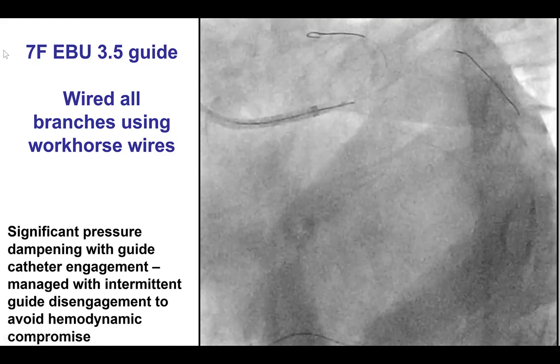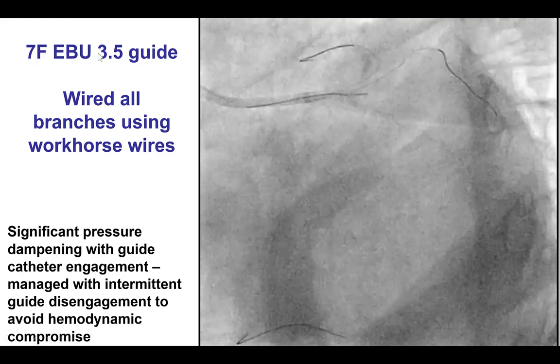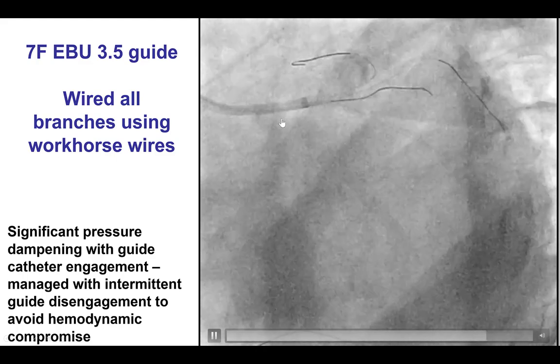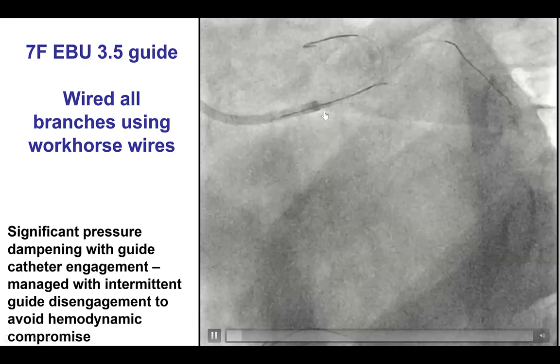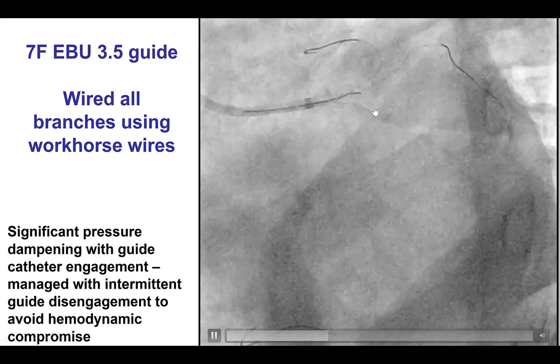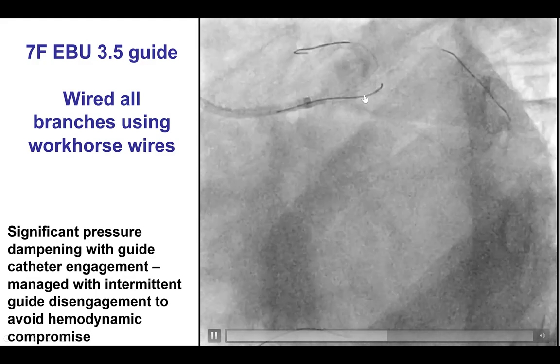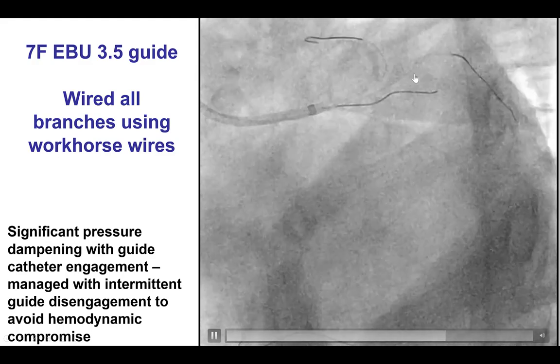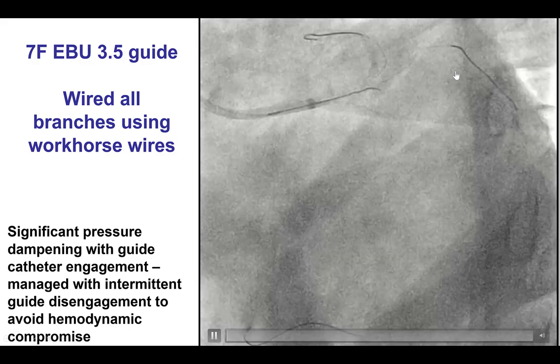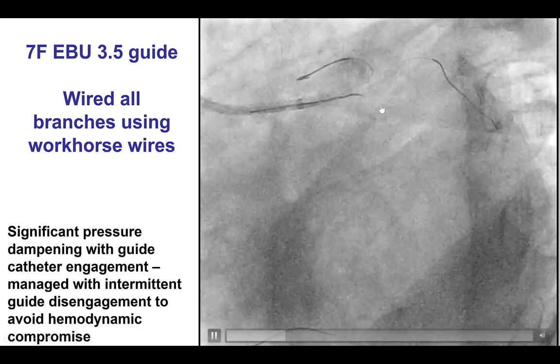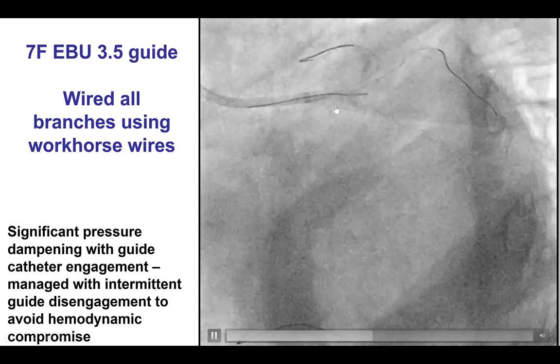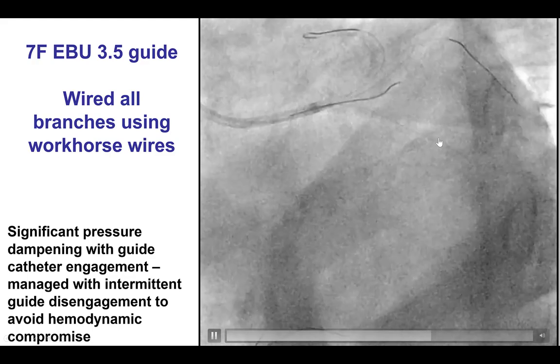We used a 7-French EBU 3.5 guide. We had to intermittently engage and disengage the guide to minimize dampening and potential hemodynamic compromise. We then used workhorse wires to wire into all branches: the LAD, the superior Ramus, the inferior Ramus — which was challenging to wire — as well as the dominant circumflex branch.